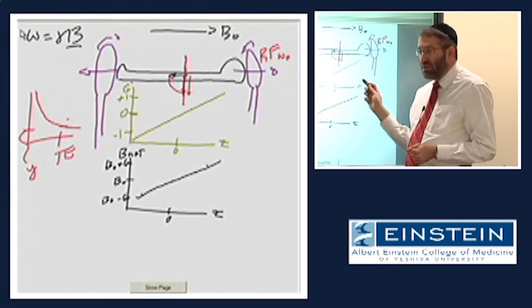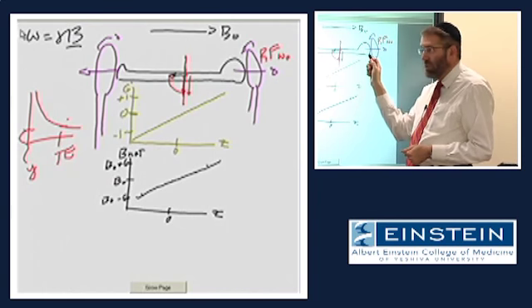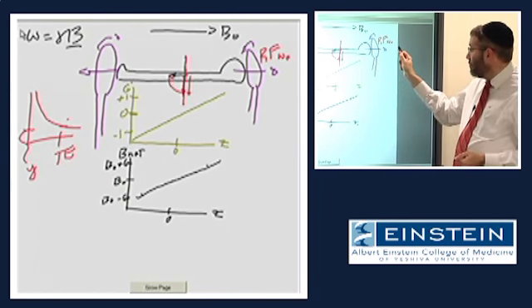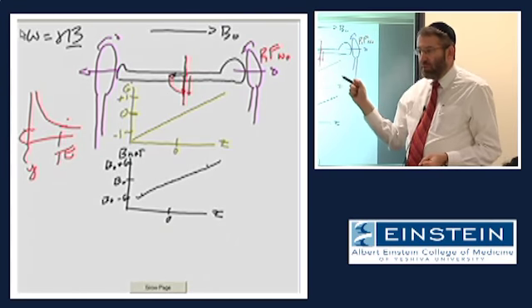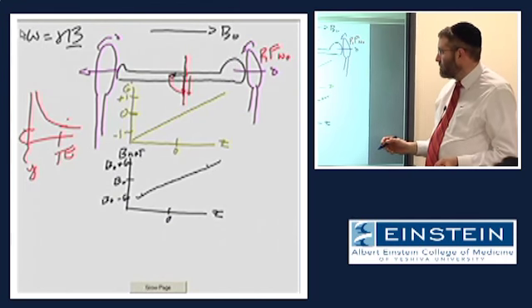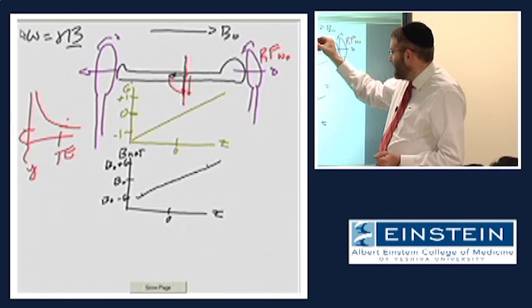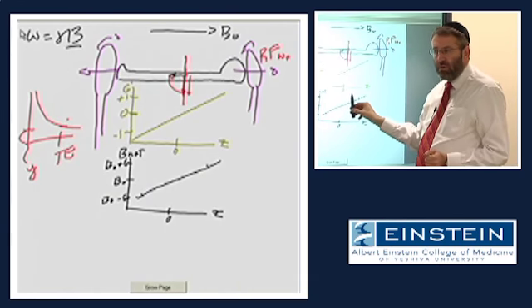The only way that we can select a slice is by manipulating the frequencies of the tissue so that the match and resonance between the frequency of the RF and the precessional frequency of the tissue only occurs within a specific plane. Okay? Now, this allows us to select a slice at the isocenter of the scanner.